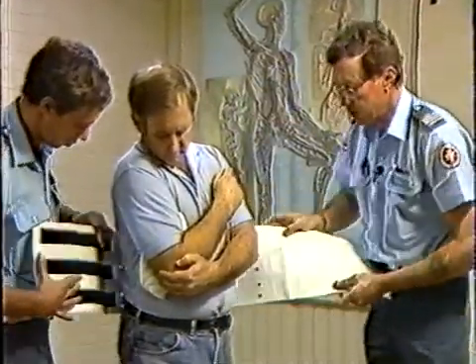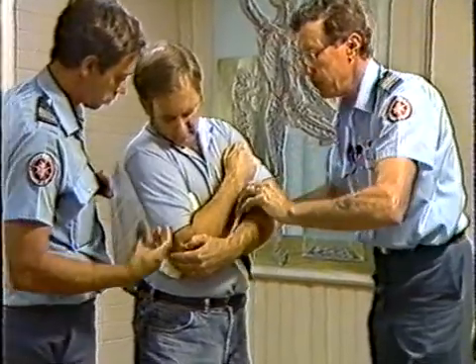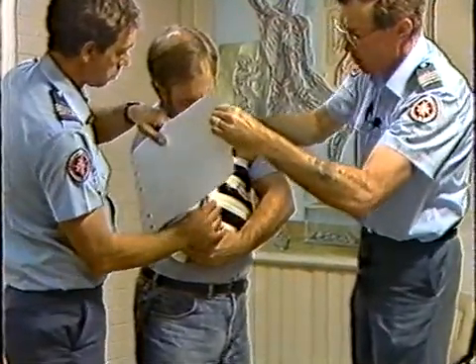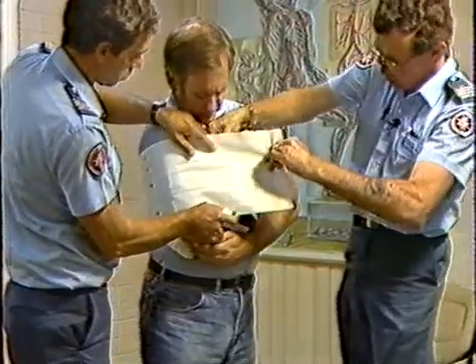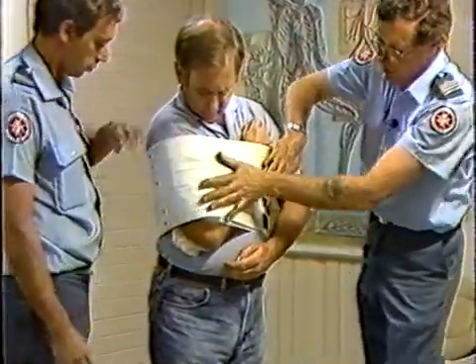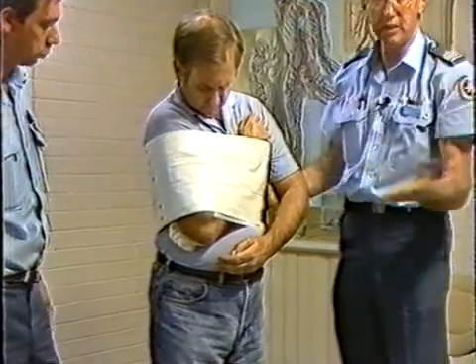So this time we come under the arm and we come up, and with this one you make sure you follow the profile of the humerus, and notice how we now have the uniform pressure right across in an even manner there, and there, done.